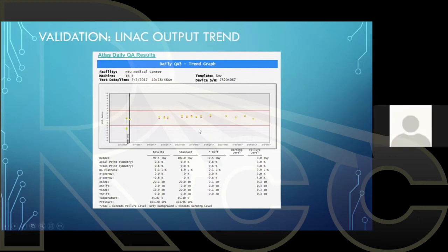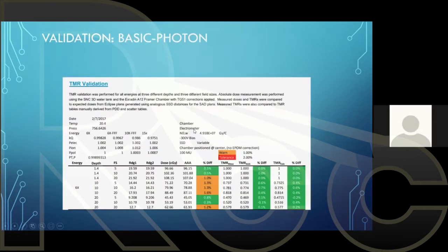Paulina, just one more question from your previous slide. I can understand that you have done all this in a homogeneous phantom. Yes, this is in water. Validating in inhomogeneities as well? Yes, and I will go there.